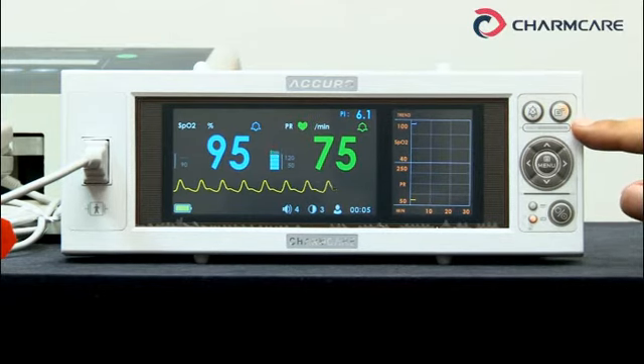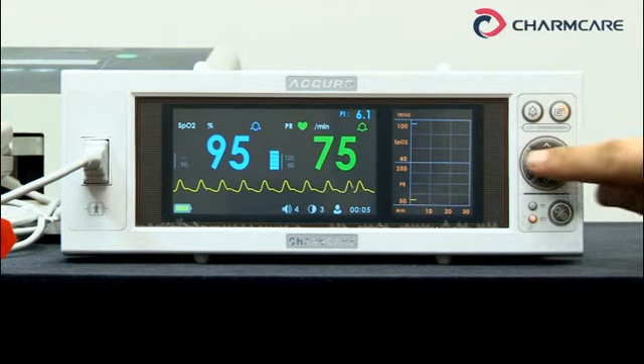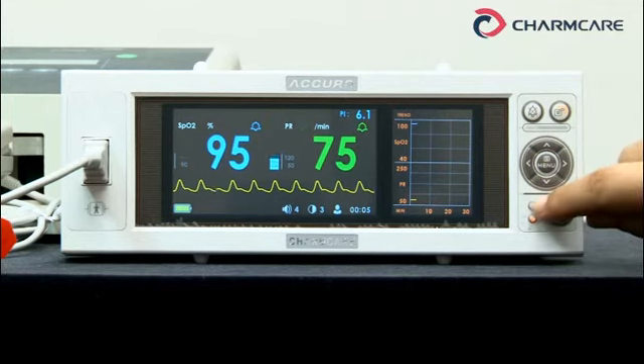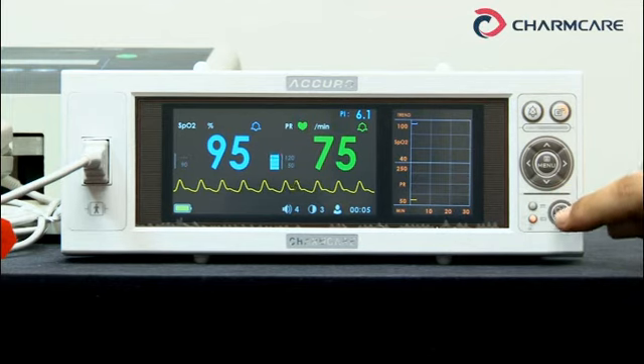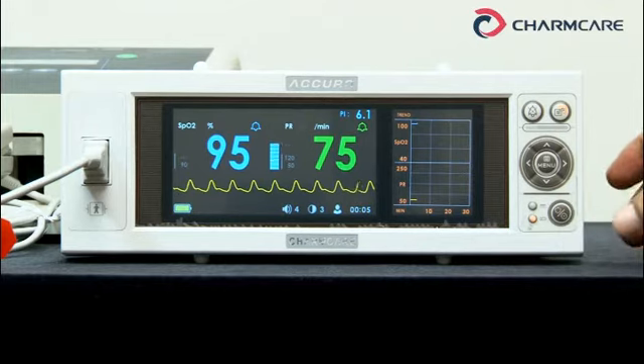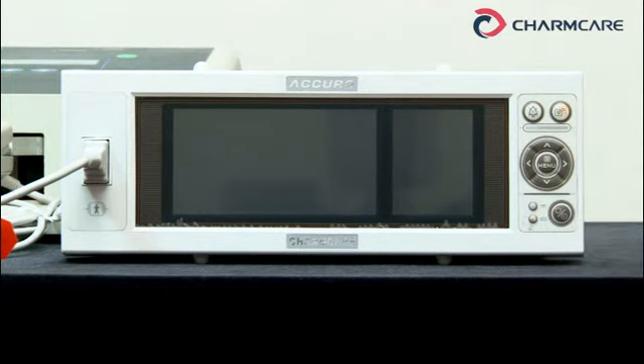This is the alarm lamp. In case of a high level alarm, the red lamp blinks. For a medium level alarm, the yellow lamp blinks. For a low level alarm, the yellow lamp stays on. These vertical arrows are for selecting; these horizontal arrows are for decreasing or increasing. The menu button is for setup and changing modes. This small round lamp indicates AC power; the one below indicates battery power — now this Acura is using battery power. This is the power button; if you hold it for 2 seconds, it turns off.